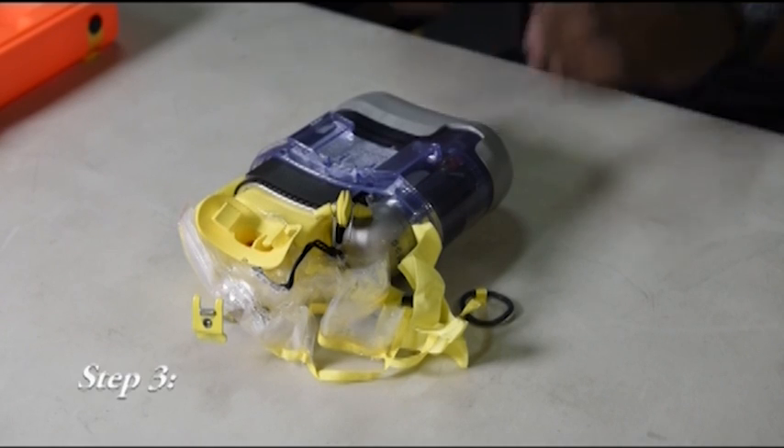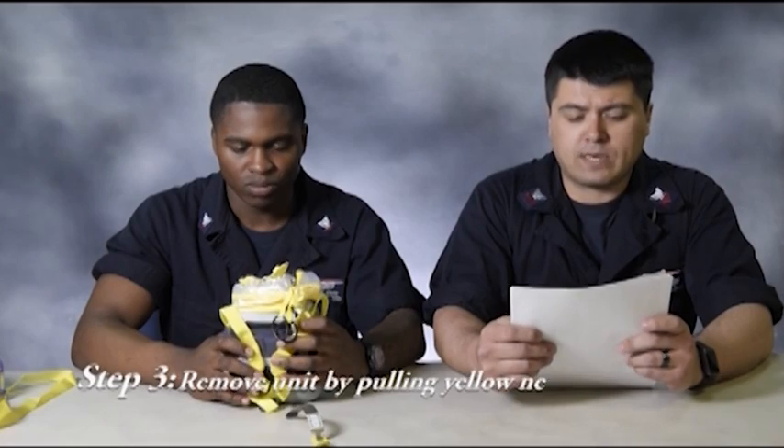Step number three: remove unit by pulling yellow neck strap upwards.